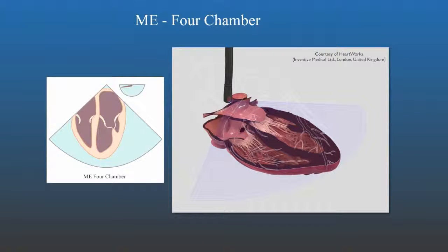a 5-chamber view. Remember that the anterior leaflet of the mitral valve is always in close association with the aortic valve. Thus, the left leaflet in this image is therefore the anterior leaflet, while the right leaflet is the posterior leaflet. This relationship will change as the probe is rotated. The four-chamber view is a reasonable way to show the viewer an overview of the heart early in the exam.